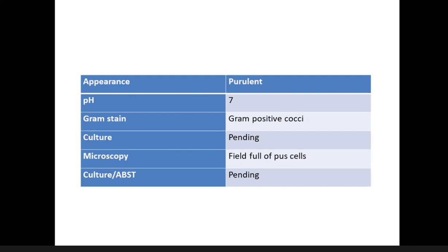Sir, in the previously shown effusion X-ray, as there is a huge effusion and no air bronchogram, why go to the diagnosis of parapneumonic effusion? Again, I say, this X-ray was downloaded from the internet for this case scenario, right? In addition, now the patient is having a pleural effusion, right?